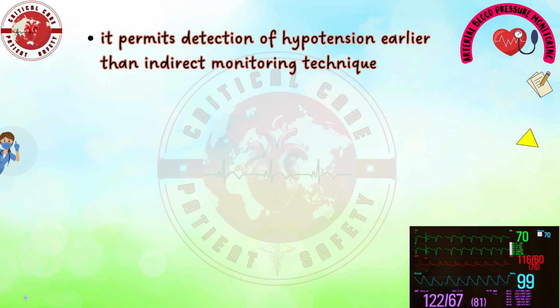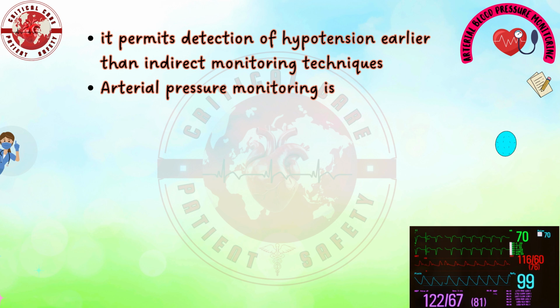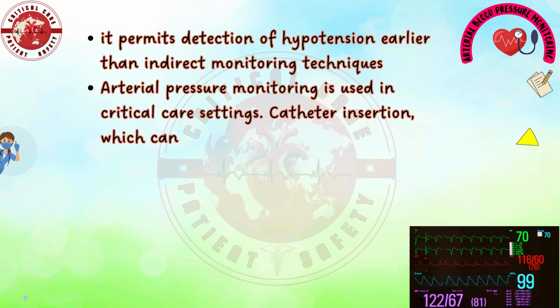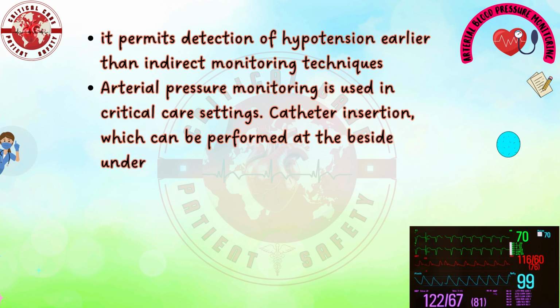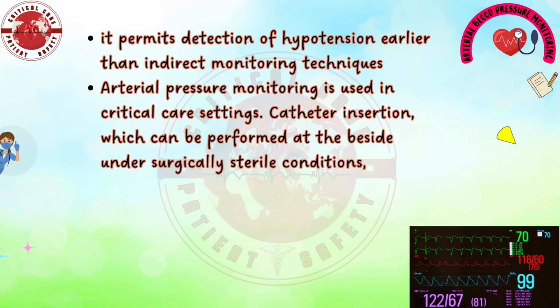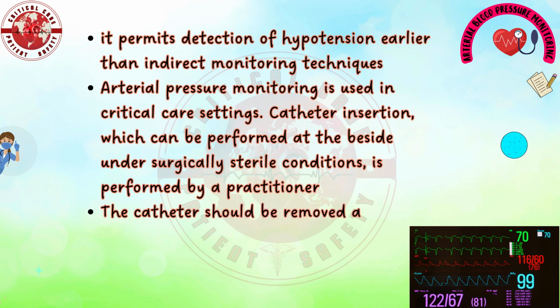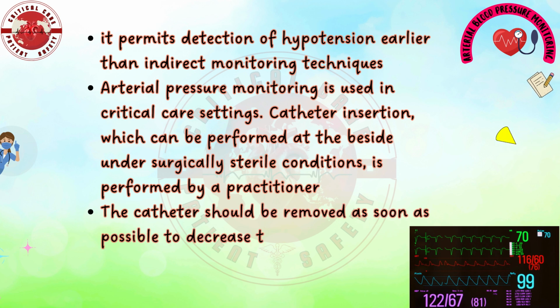Arterial pressure monitoring is used in critical care settings. Catheter insertion, which can be performed at the bedside under surgically sterile conditions, is performed by a practitioner. The catheter should be removed as soon as possible to decrease the risk of complications.